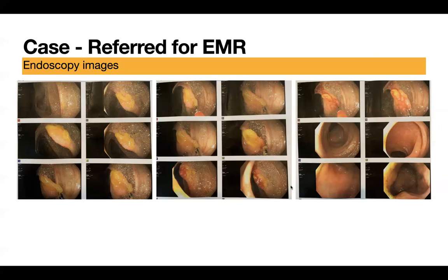The best way to do that is to flush simethicone through the biopsy port rather than putting simethicone in the water jet. That's one thing to keep in mind. The other thing I've been doing of late is I tell all my patients to chew Gas-X.